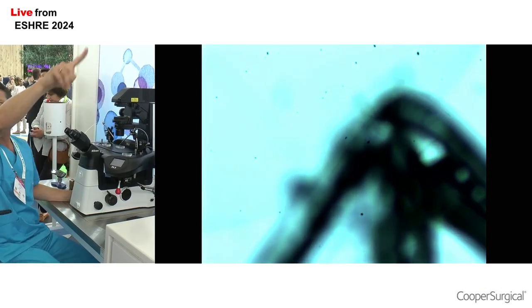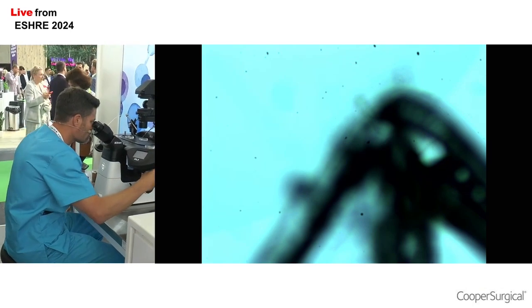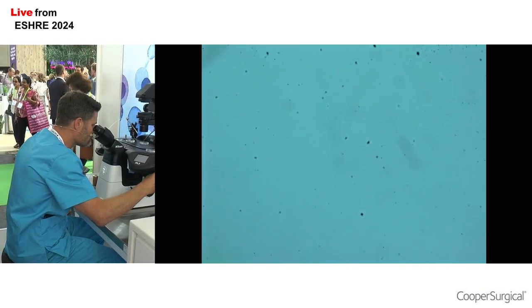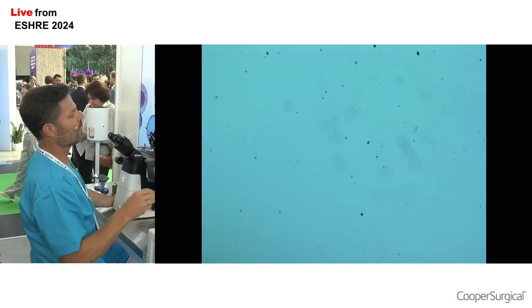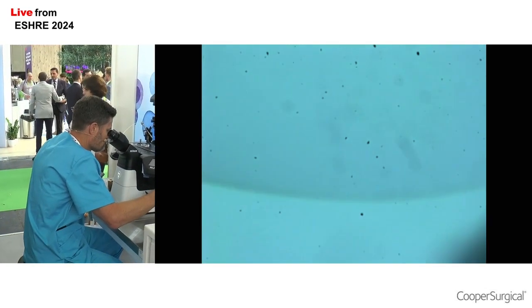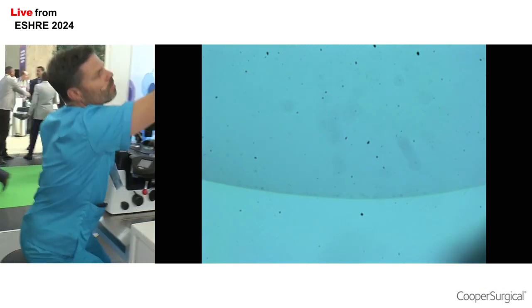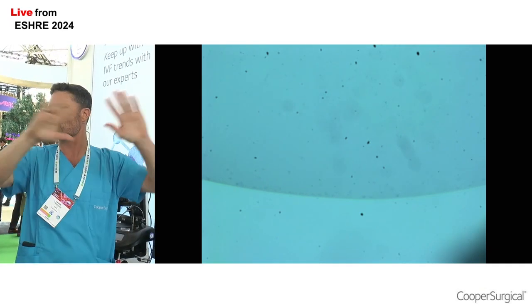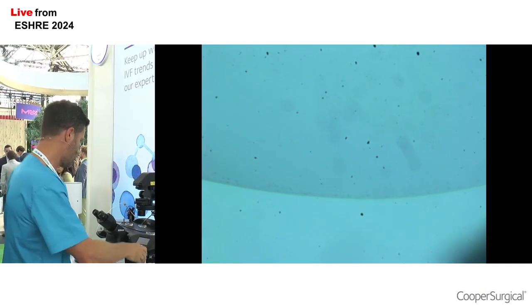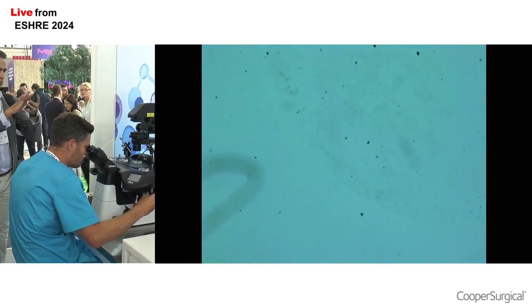This is the arrow that you can see now on the dish, okay? And what you see here is where the media starts. So this is not the hyaluronic acid, this is where the drop with the media and all the sperm starts. And what I'm going to do is start moving up, and you'll see, hopefully.